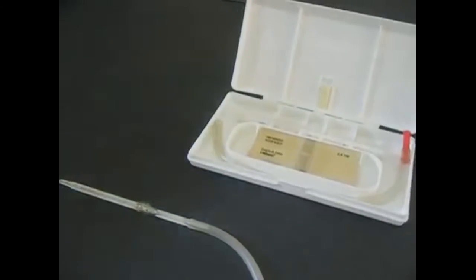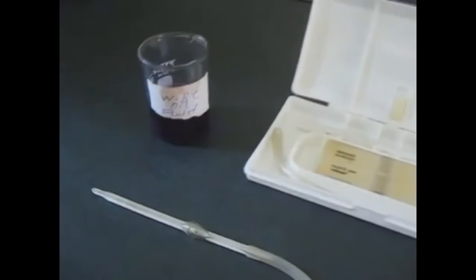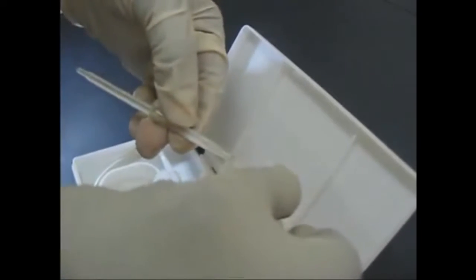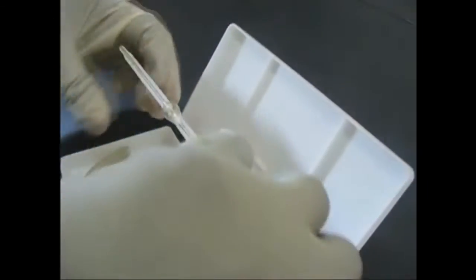A white blood cell diluting fluid is also required. A plastic tube for pipetting is attached to the white cell pipette and made ready for use.